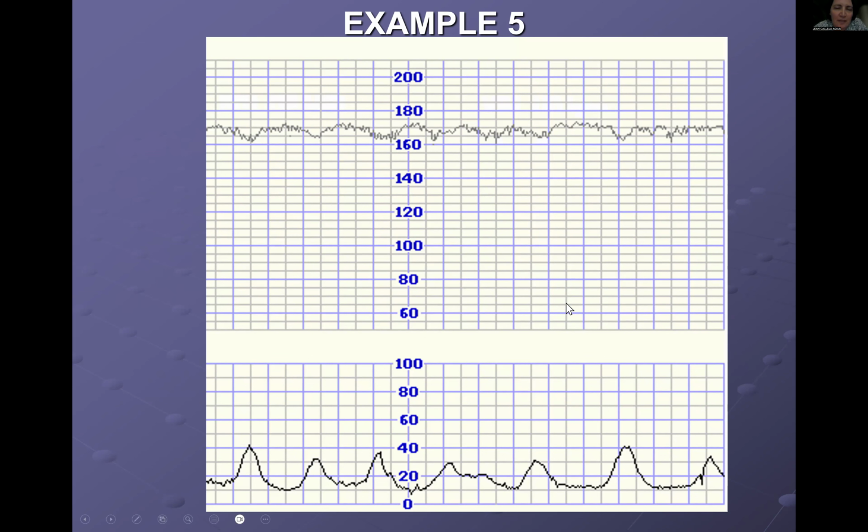What about the baseline rate? For baseline rate here, I would say 170 beats per minute. Yes. You're very good, Philip. It's 170. Because again, the temptation would be to say, oh, it's about 160 to 165. But no, this is the baseline rate, 170. It's true she's at 40 weeks, but she's been in labor for quite some time, with rupture of membranes for some time. So we're not entirely happy with the baseline rate of 170. So it is tachycardia. Yes.